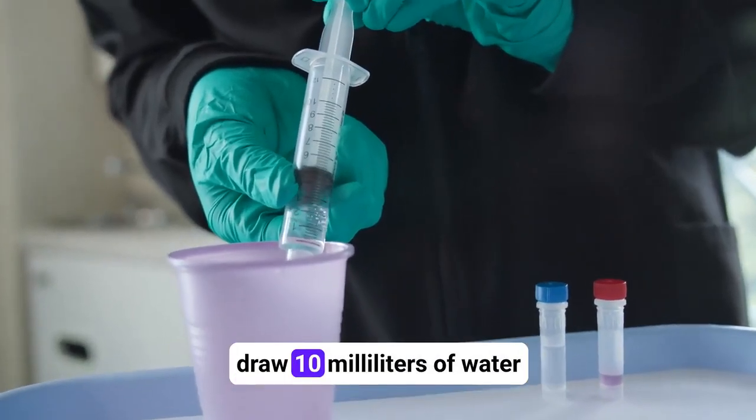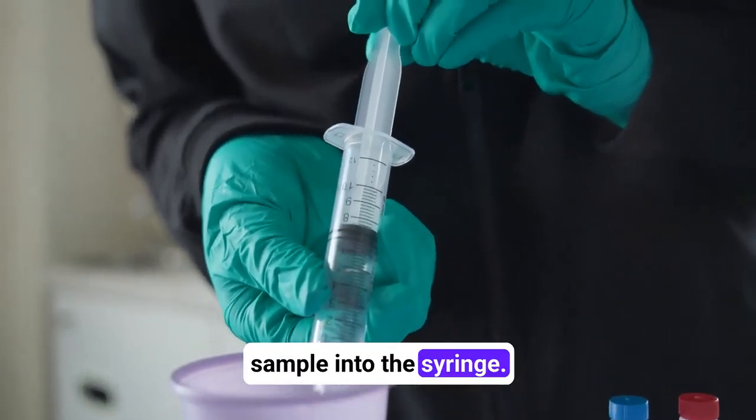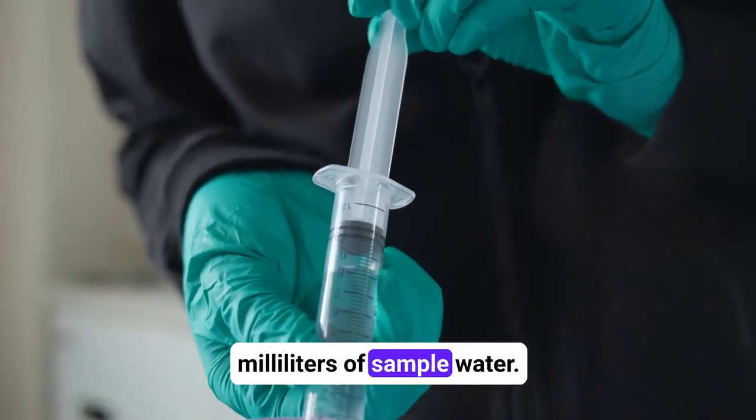Slowly pull back plunger and draw 10 milliliters of water sample into the syringe. Do not draw the full 20 milliliters of sample water.